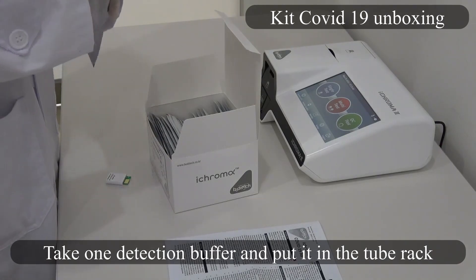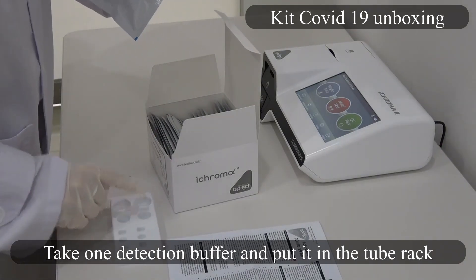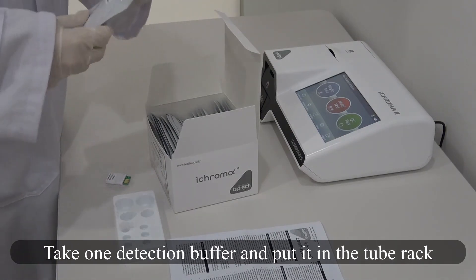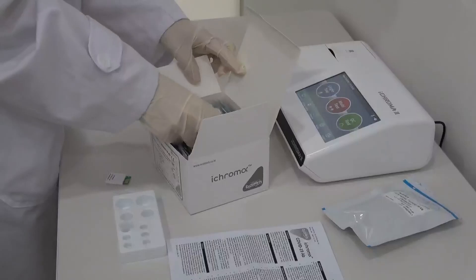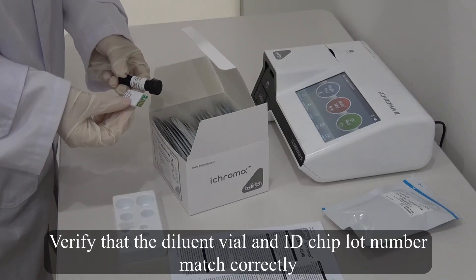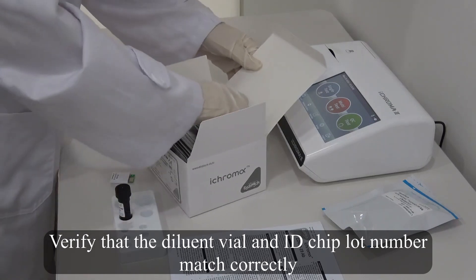Take one detection buffer and put it in the tube rack. Verify that the diluent vial and ID chip lot numbers match together correctly.